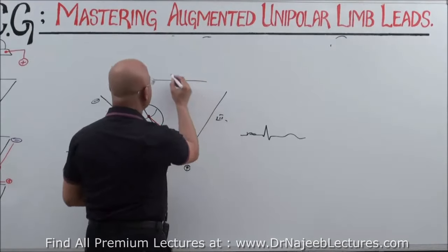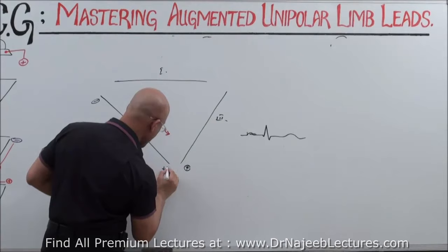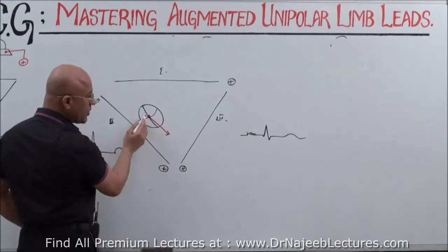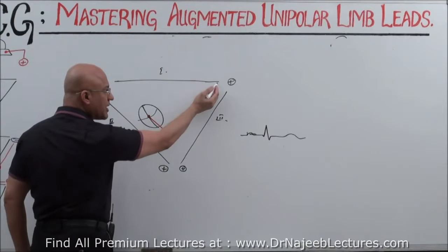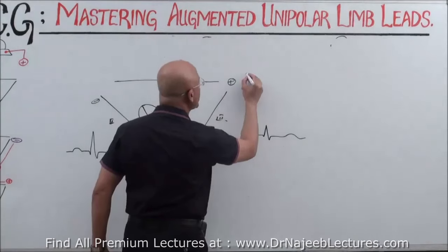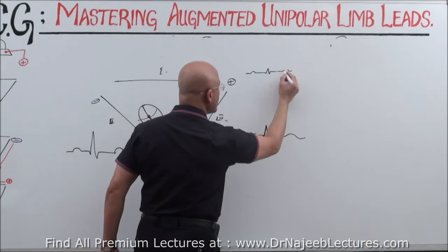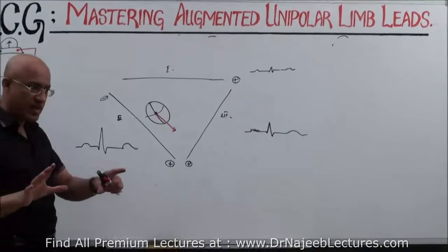And if you look at lead number 1, this was 2, this is 3, and this is lead number 1. Because vectors are going downward and also leftward, the leftward component will be detected by this lead, but that is a very small component, so it will come but with very, very little fluctuation.